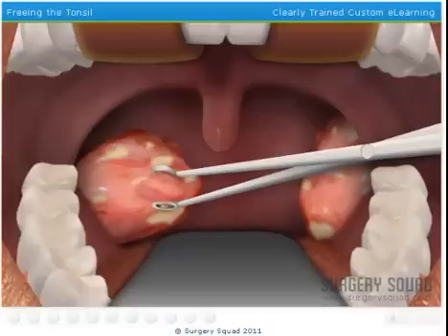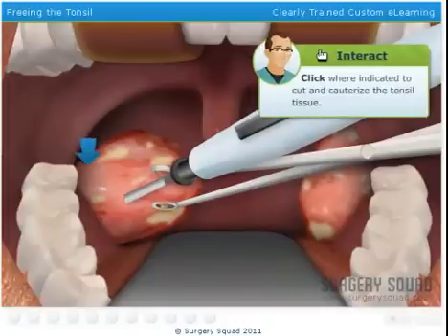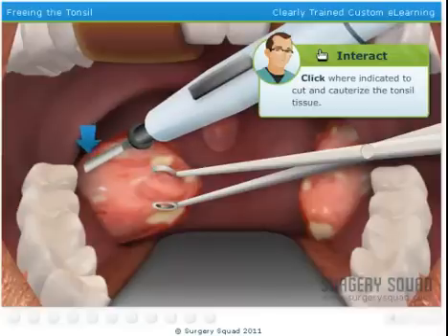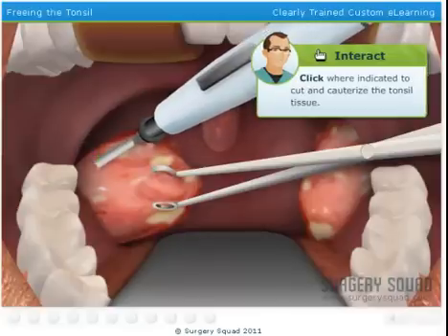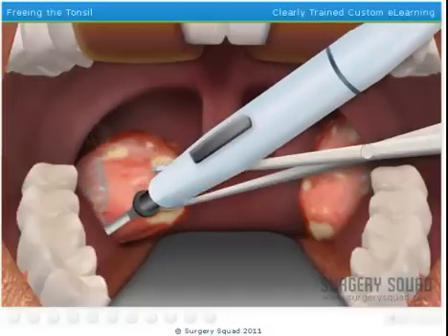With the tonsil extended out, we need to place this electrocautery device at the tonsil's base. The device uses high frequency current to cut away tissue and seal off the blood vessels at the same time. By removing the tonsils this way, we reduce bleeding and allow the patient to heal faster.